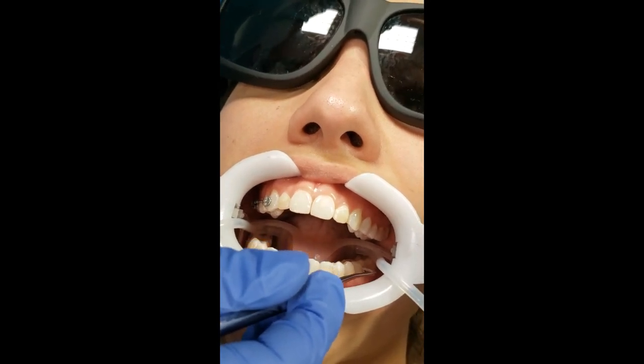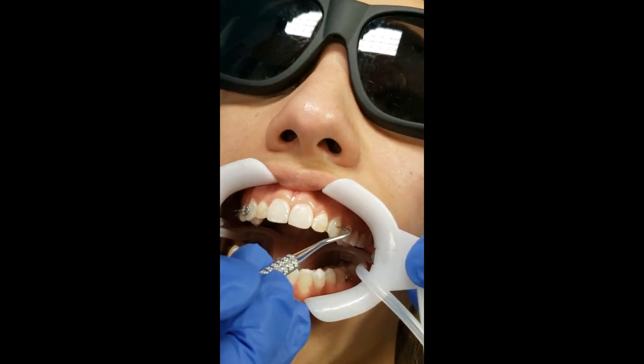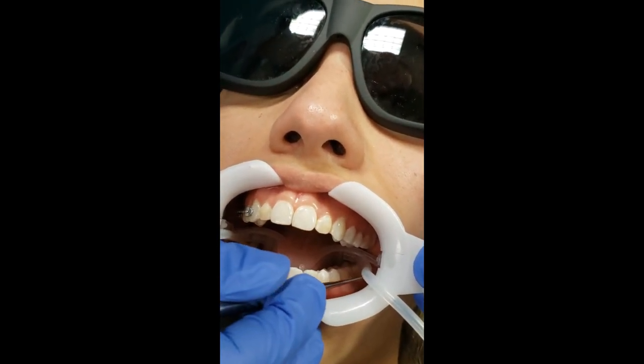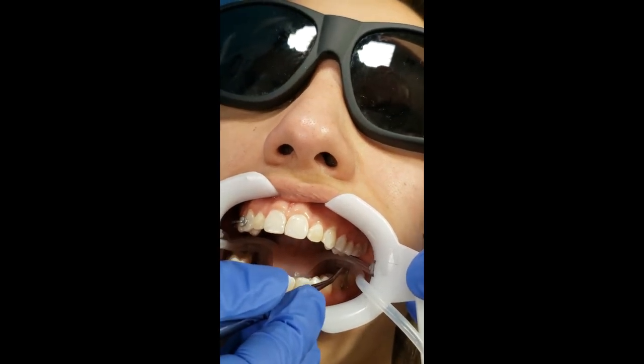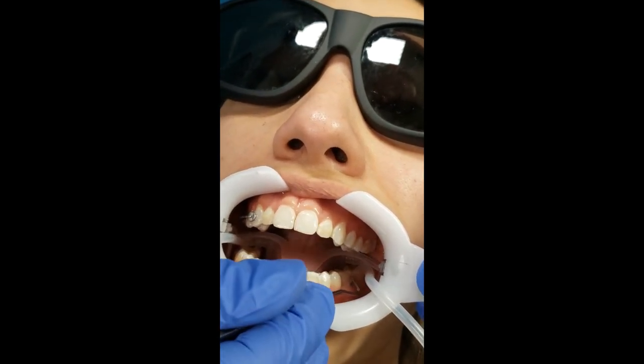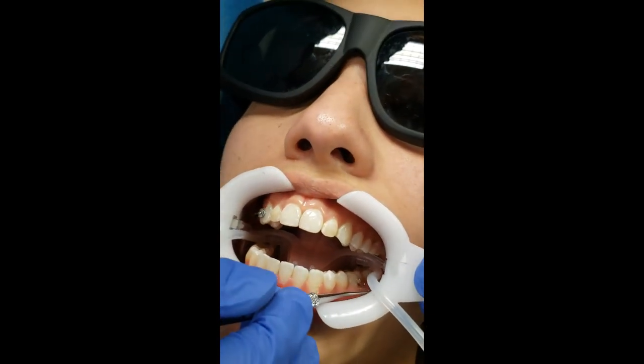Push it in to get that excess and use the micro brush or scaler to fold over the rest. As you're placing it, think: if we're wearing the elastic from here to there, is the elastic going to stay on? Is she going to bite on it? These are the things you're thinking about as you're placing it. That looks pretty good.